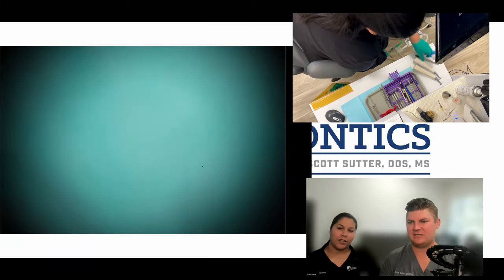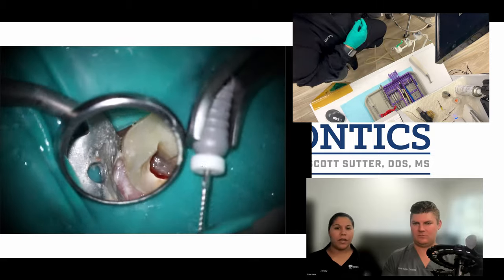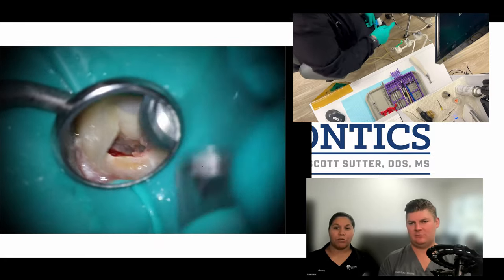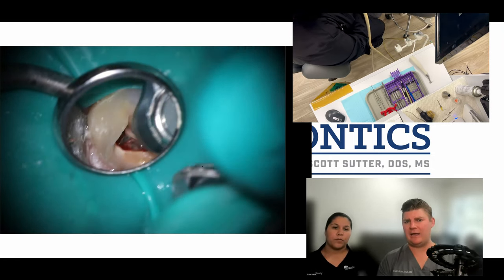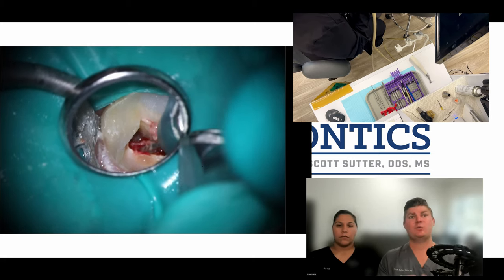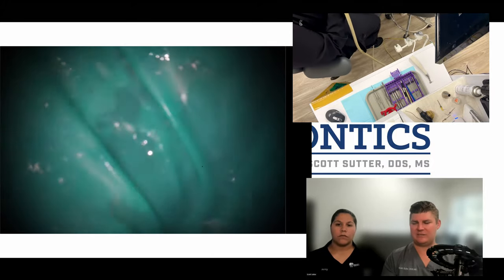At this point we are finally done with the access. Jenny has handed the file to the doctor, and with a couple of free seconds she's automatically turning on the rotaries — what he's going to need next — so when she hands it over it's on and ready to go. After swapping it out, she preps to rinse the area, because every time after using a rotary we do rinse. We keep things nice and small, wanting to use every opportunity to get irrigation solution inside the tooth and rinse after every rotary to avoid debris that could bind the canal and cause an instrument separation.